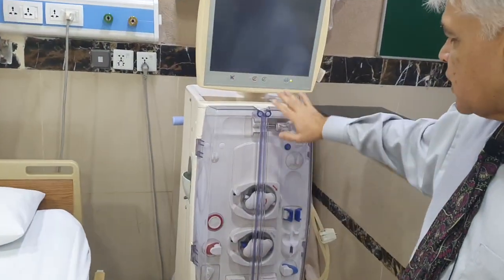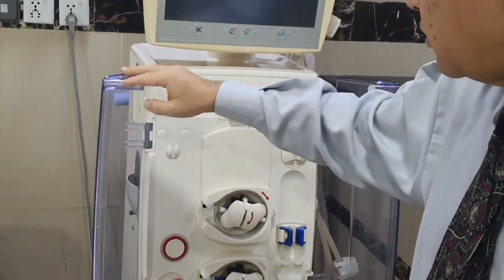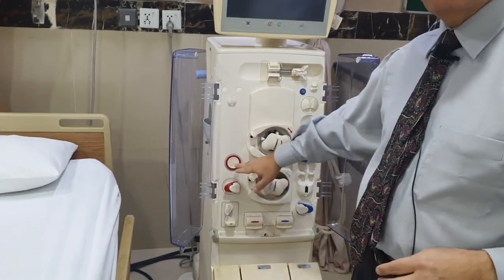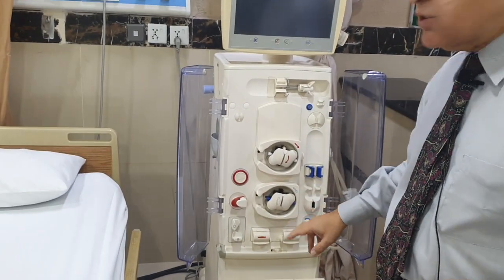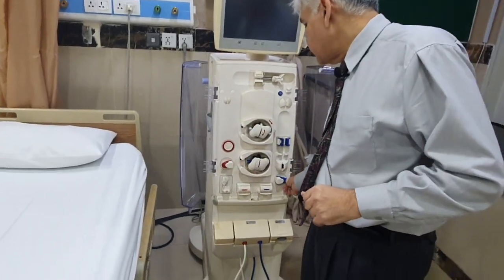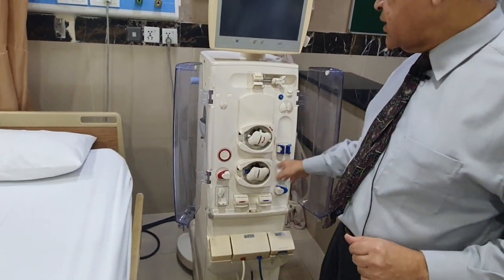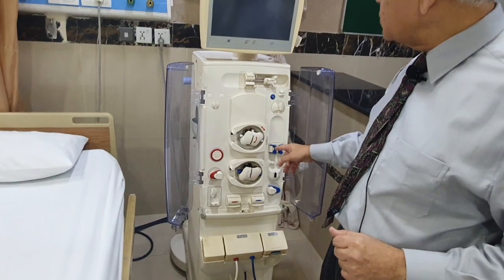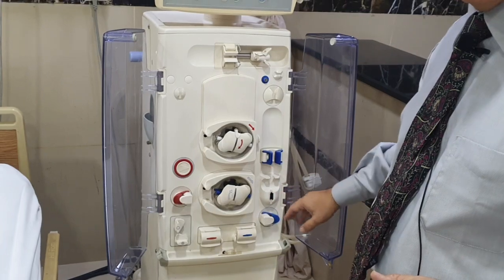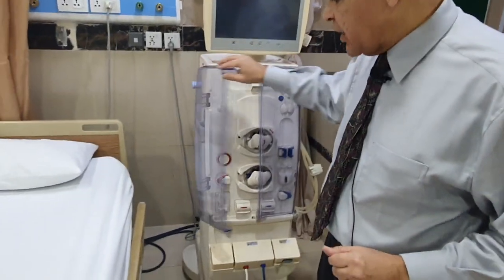you'll get a monitor which actually shows you all the various functions, and then down here you've got the different parts. All the dialysis machines now will be marked red and blue. Red means the artery, and the blue means the venous part. The red and blue are important when it comes to these sections, and that's where the blood tubing line goes in. These are the pumps, and these will make sure that the blood flows properly through the circulation. Up here, we've got the heparin pump, and we've got the various sensors which are located in the machine. In a minute, I will turn this machine on, and I'll show you how this machine actually works.